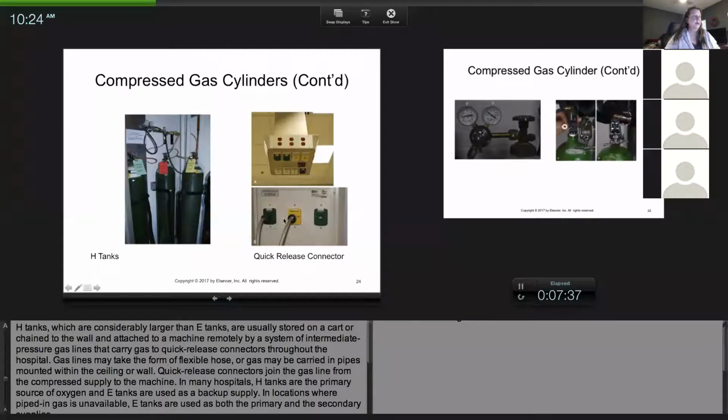Yes, Michaela, I don't know if you look at this picture here, yellow is compressed air. So some ventilators and some power equipment use what's kind of called medical air, but it's just compressed air. And that's a yellow connector. Black, I think, is nitrogen. We use nitrogen tanks to power our surgical drills. So that was a black tank and a black connector. So they are color coded.